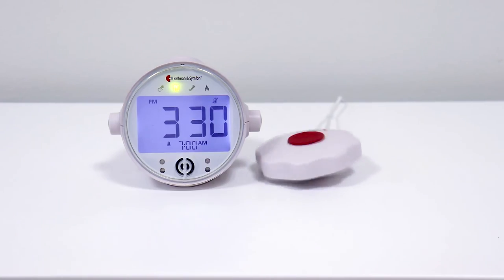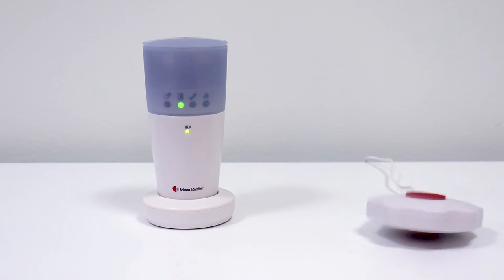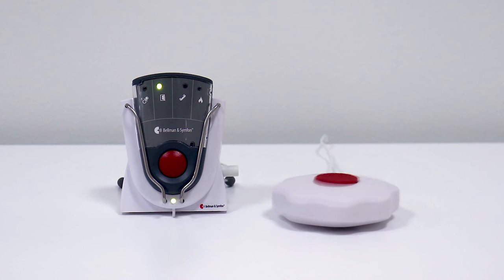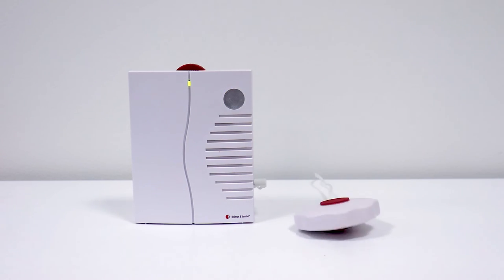When the receiver is activated, you will also be notified with strong vibrations from the Bed Shaker. And that is the Bed Shaker.